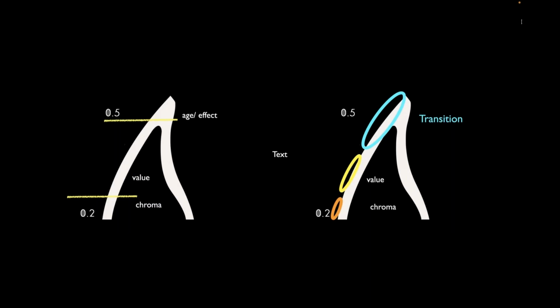And by the way, when I work through my cases, I think most of you know that I built something called a canvas concept. And in that canvas, I'm usually looking at my chroma in the cervical, value in the middle third, then a certain amount of effect or translucency towards the incisal. Well, I want to treat my enamels exactly the same. If I want to increase my chroma in the cervical, maybe I'm going to use a very transparent type enamel that has a lot more color to it or chroma to it. This way I'm emphasizing the color in my cervical third.